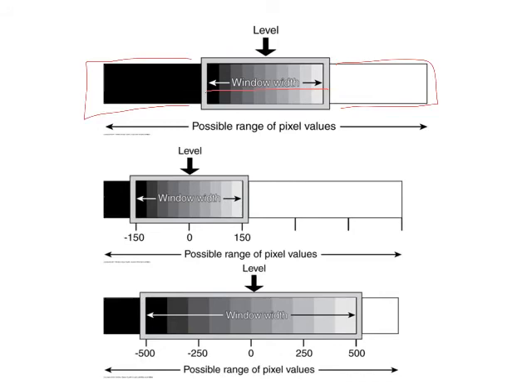This is powerful to know here, because this will tell you everything you need to know when you're looking at a CT image in terms of attenuation. So I can change the window. The other thing is the level. The level is that centered pixel value, like what pixel value did I say to center on? It looks like initially this window level is at the 0 point of the Hounsfield scale, but I can change that. I could move my window level in the negative direction and center on something like fat.